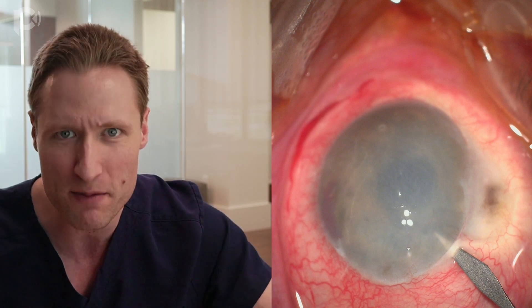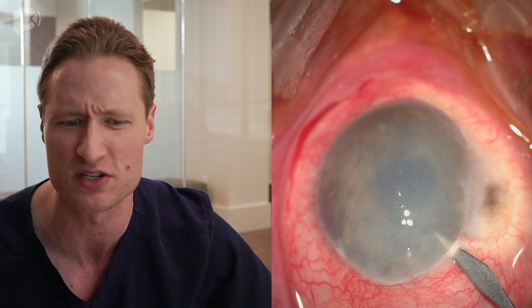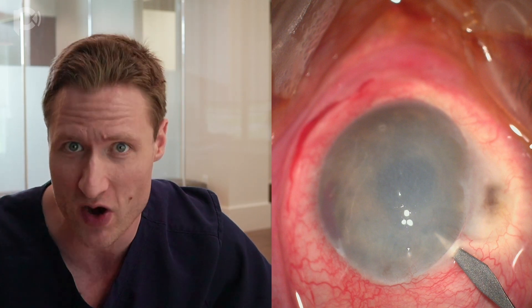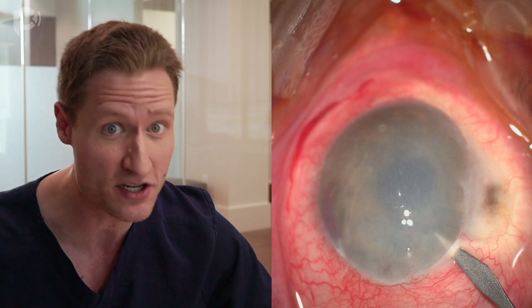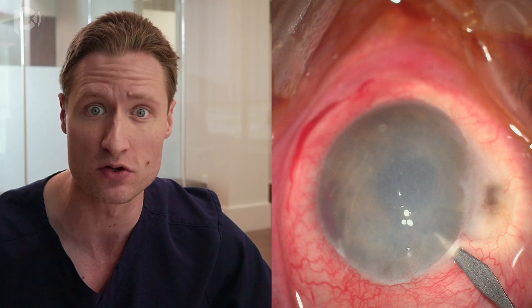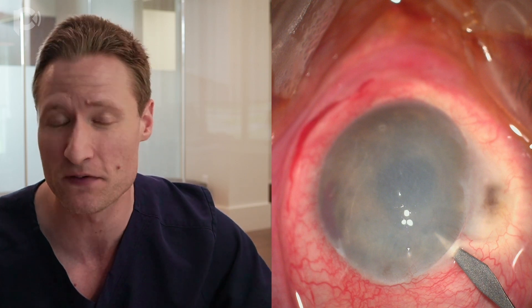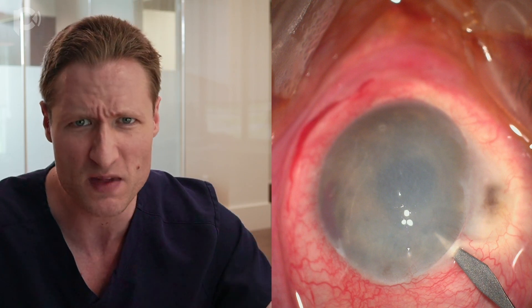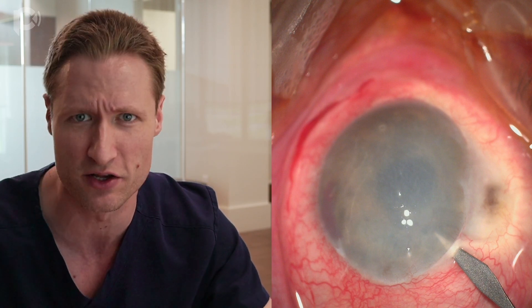Here is what the eye looks like as we start the case. You'll notice there's a bleb at 12 o'clock — so this eye has previously had a trabeculectomy. This eye has also had at least one, if not multiple, retinal detachments. The cornea is extremely hazy and fibrotic, and there is bleeding from the inferior angle when we start the operation for reasons that are unclear. The chamber appears a little bit shallow.